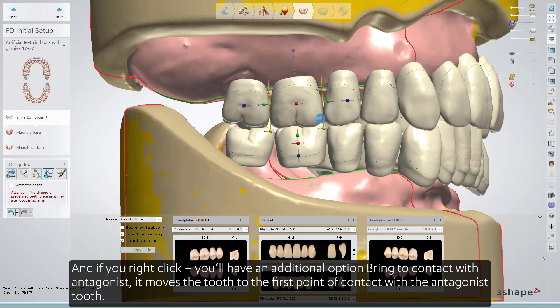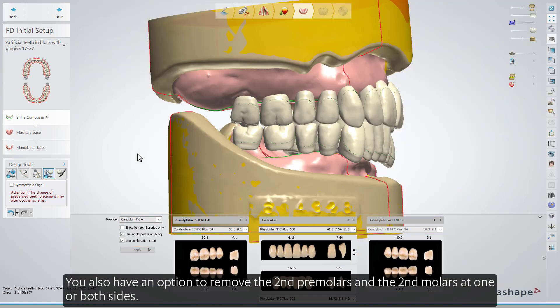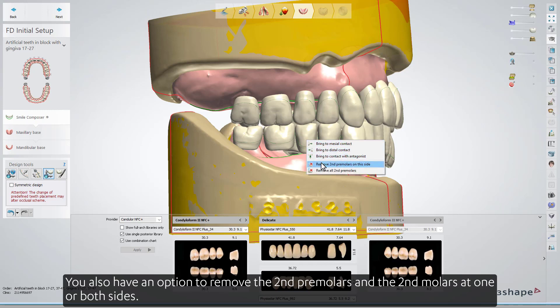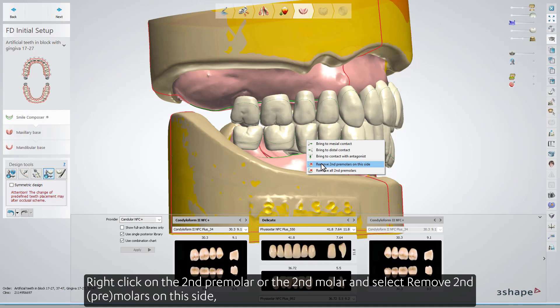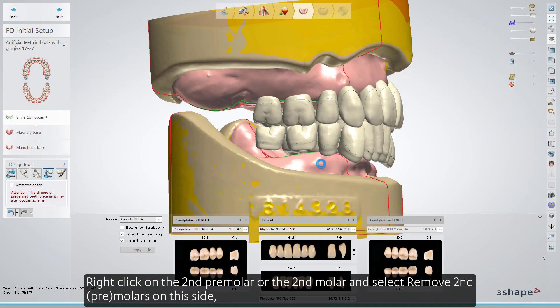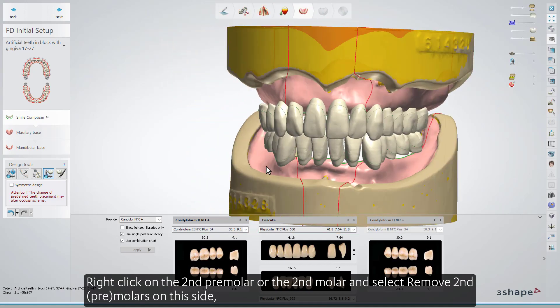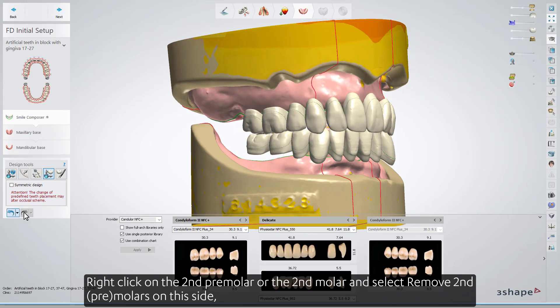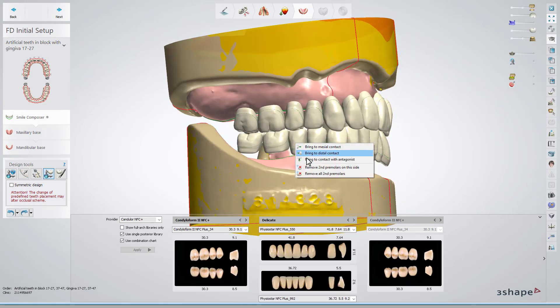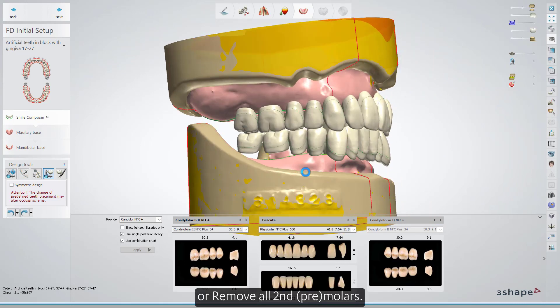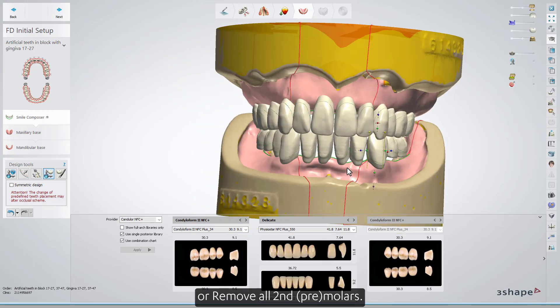Bring to Contact with Antagonist moves the tooth to the first point of contact with the antagonist tooth. You also have an option to remove the second premolars and the second molars at one or both sides. Right-click on the second premolar or the second molar and select Remove Second Premolars on this side, or Remove All Second Premolars.